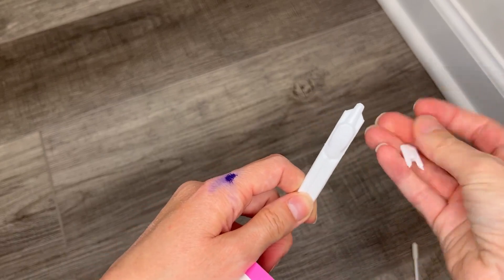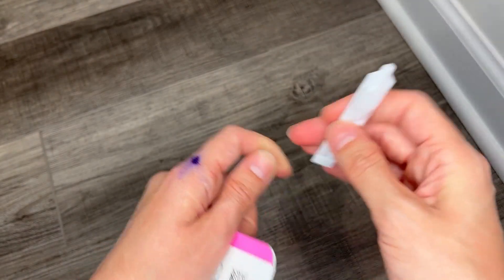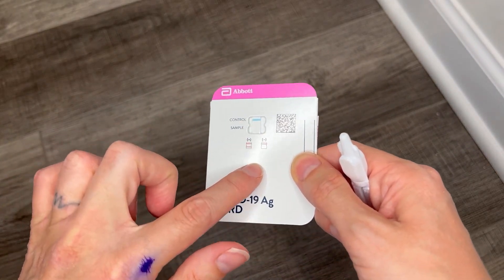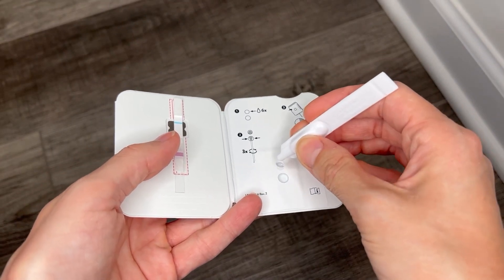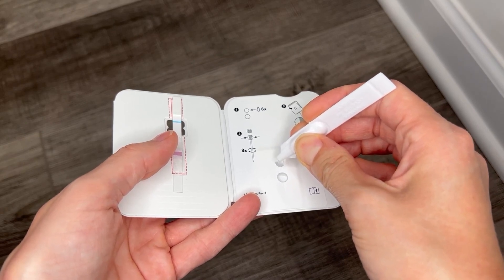So this comes with a lid and you just twist it off and then you go to your test card and this is the test strip right here. And you open it up and you put six of these drops in the top here. One, two, three, four, five, six.